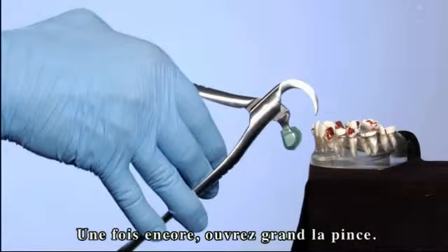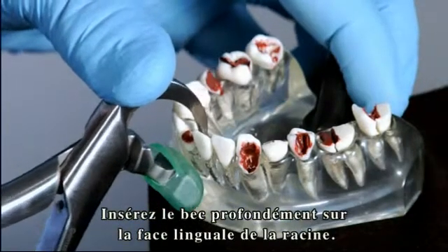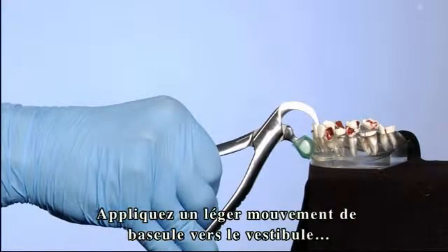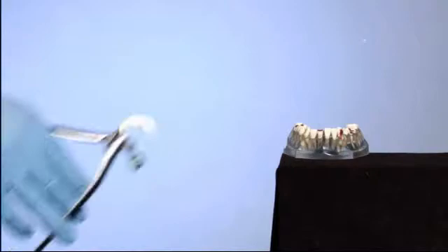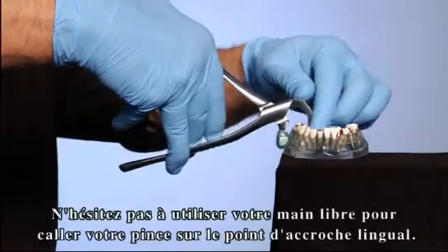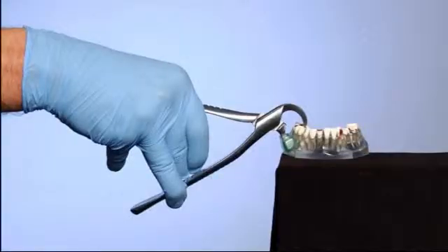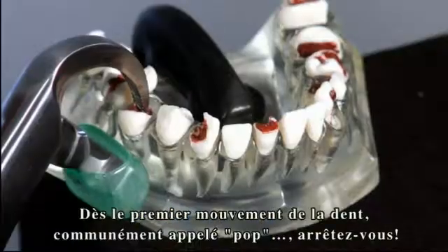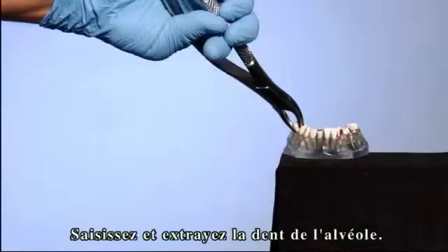Once again, open the instrument wide. Then engage the beak deep on the lingual aspect of the root. Next, set the bumper at the mucogingival junction. Slowly apply pressure rolling in an arc towards the buccal to accomplish an occlusal lift. Do not hesitate to use your free hand to assist in securing a proper purchase point. Do not squeeze the handles. At the first sign of movement, or what is commonly referred to as the pop, stop. Grasp and remove the tooth from the socket.